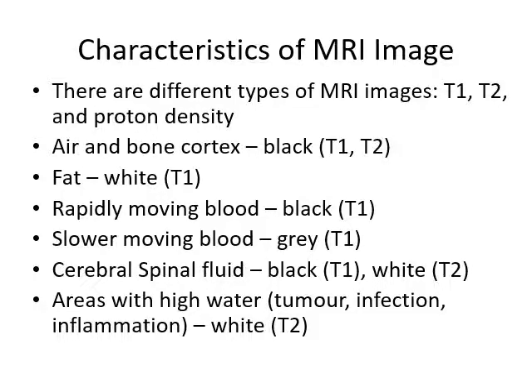And then areas with high water content, so if you've got something like a torn meniscus or joint problems where you've got a lot of swelling, the water will come up quite white colored. Again, if you have an infection, you've got a lot of liquid and inflammation in there, so that's going to come up white colored in the T2. That's one of the things that you're looking for.